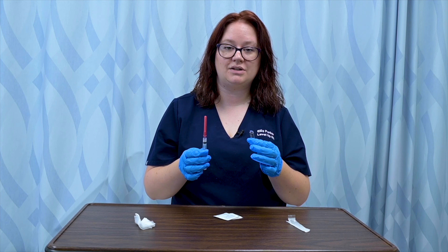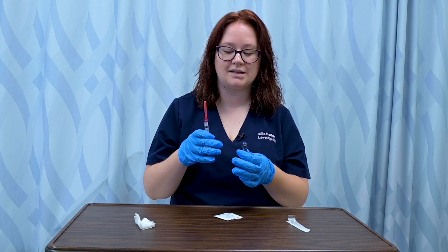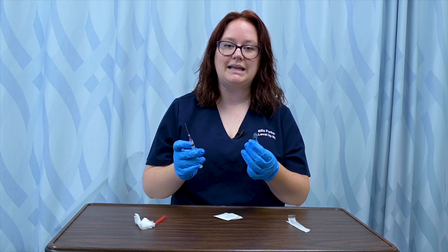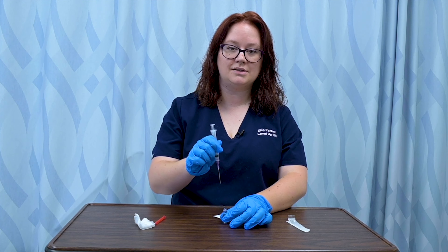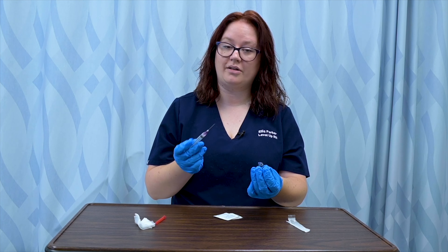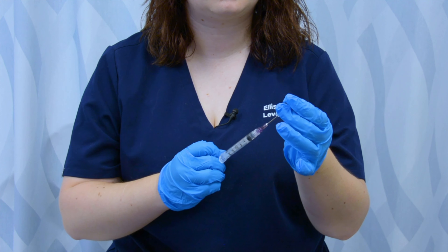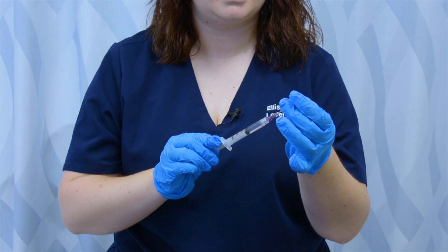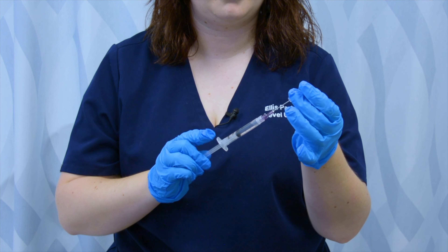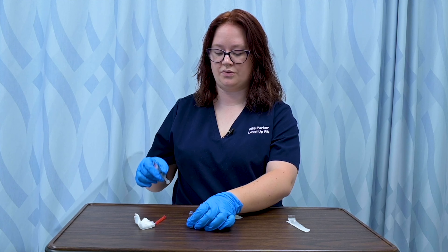When withdrawing medication from the ampule, I must use a filter needle. This is a special needle that filters the medication as it's drawn up, making sure no glass particles are pulled into the syringe. I remove the cap from my filter needle. I can withdraw from the ampule a few ways — placing it on the table like a vial, or inverting it. I personally prefer to invert, as I find it easier to handle. So I insert my needle and withdraw the correct amount — let's say two milliliters.